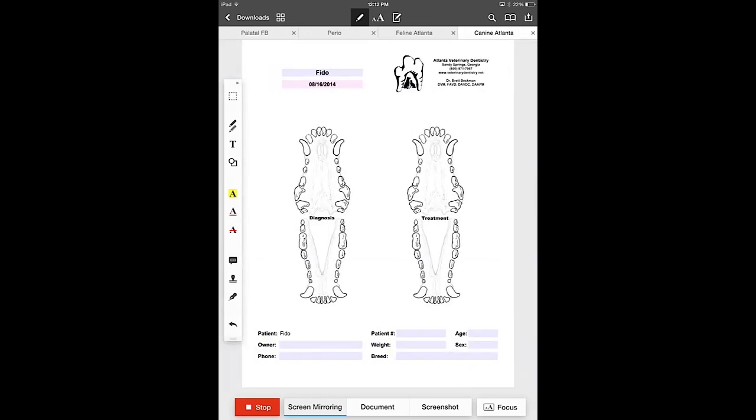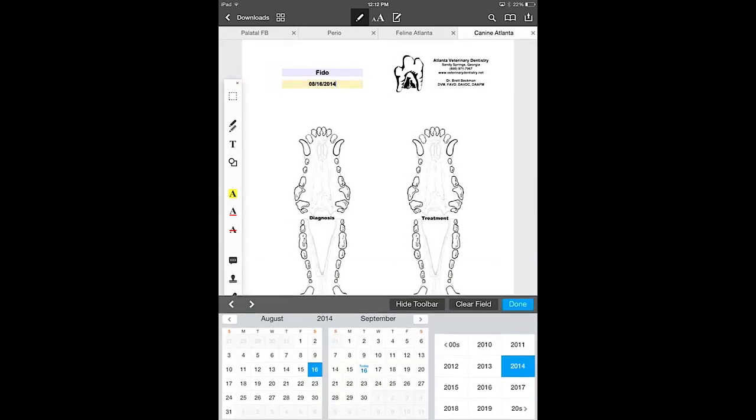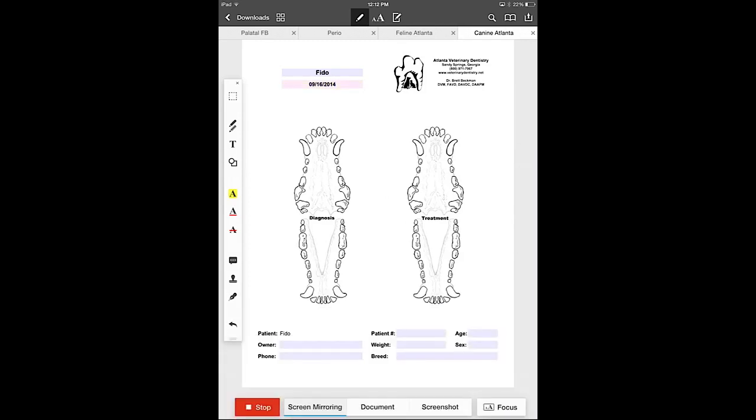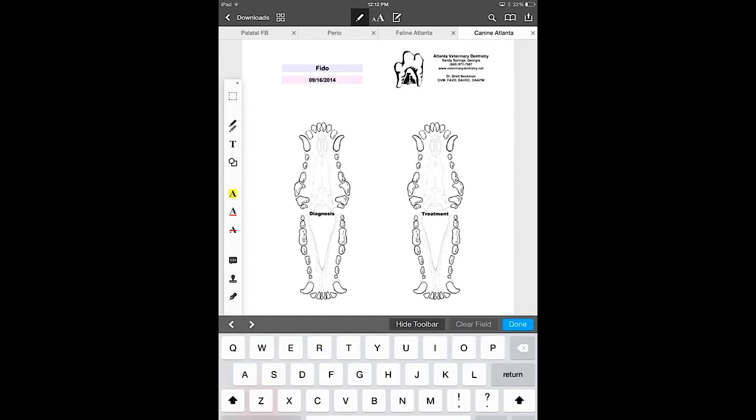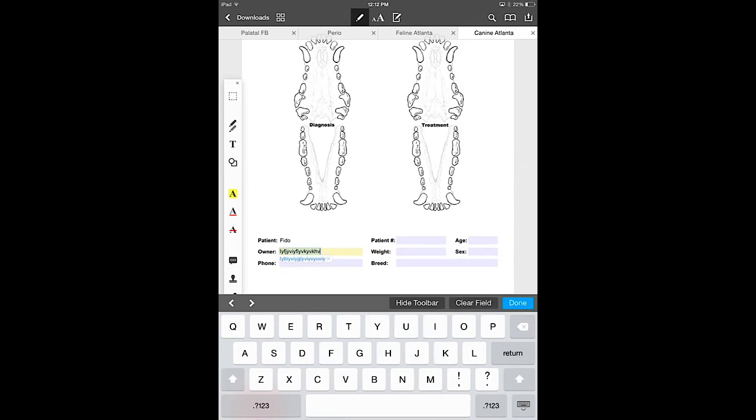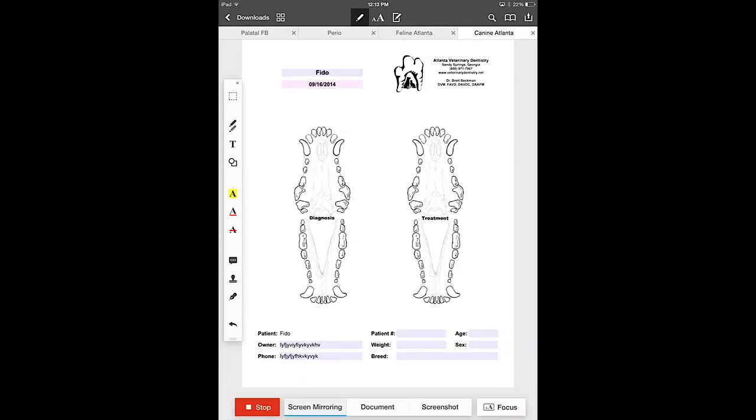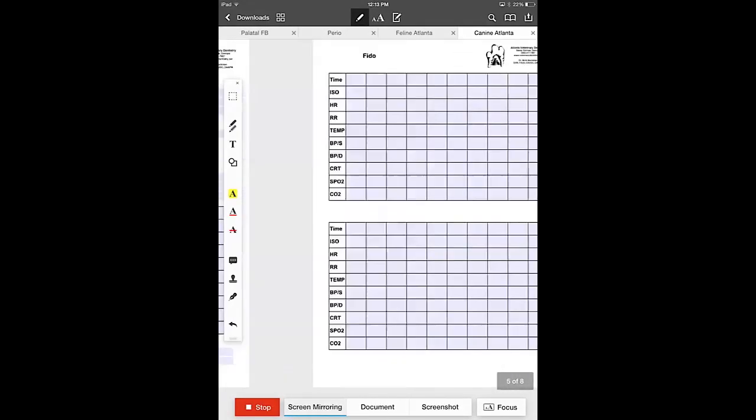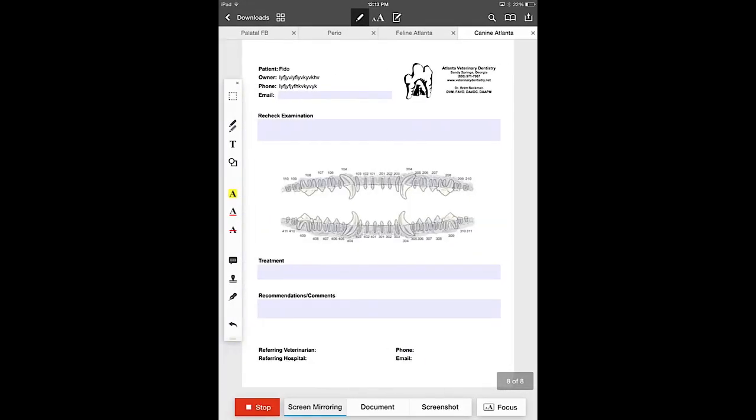That's called an auto fill function. We also have the date field underneath that. You tap on the date field you go to today's date on the bottom under September that's highlighted in blue and you can tap that and it automatically fills with the date today's date. You'll notice on the bottom where it says patient FIDO has filled there as well and when we auto fill, when we fill these as well those are going to fill to the last page on the recheck page. So that's all already filled in for you at the top left so that you don't have to do that when the patient comes in for a recheck.